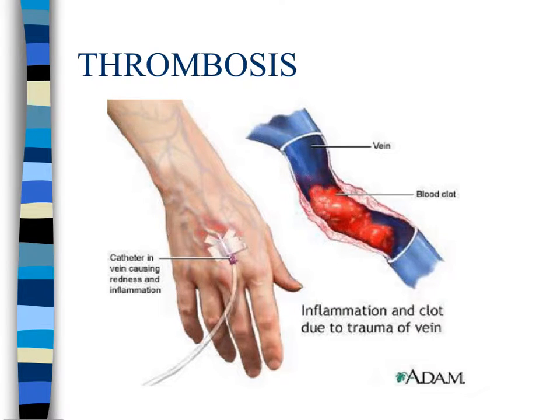Thrombosis is another type of complication and occurs when blood flow through a vein is obstructed by a local thrombus. This occurs when there's injury to the endothelial cells of the vein wall, allowing platelets to adhere, and then the thrombus would form. Signs and symptoms include painful reddened and swollen veins, a sluggish or stopped IV flow, inability to flush the catheter, although the site may look healthy.